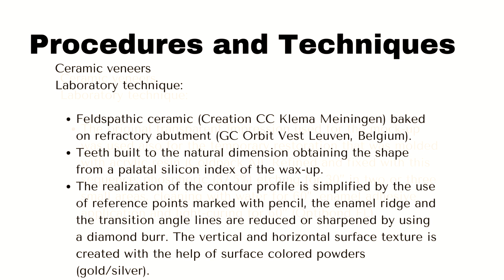Feldspathic ceramic was being made on refractory abutment. Teeth were built to the natural dimension, obtaining the shape from a palatal silicon index of the wax-up. The realization of the contour profile is simplified by the use of reference point marks with pencil. Enamel ridge and transition angle lines are reduced or sharpened by using a diamond burr.